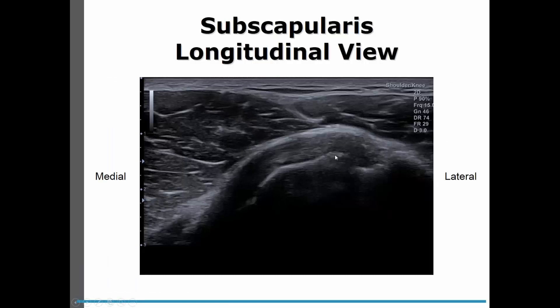As we look at this, we're going to see our bicipital groove again and we're going to see our subscapularis tendon coming off. The subscapularis tendon fibers on top are perpendicular to our beam or parallel to our probe. So we can see these well, but as it dives in, because of the angle, it will look anisotropic as well.